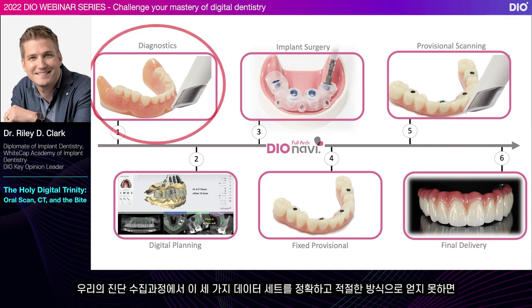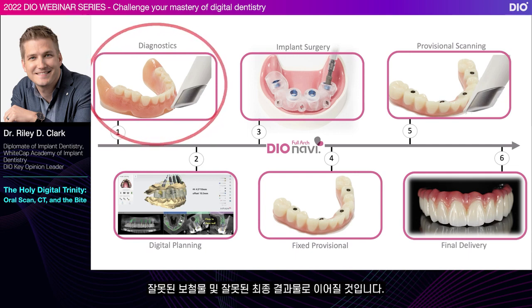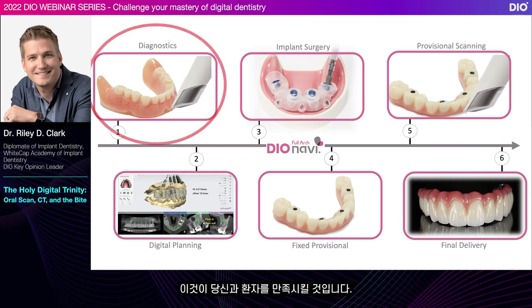If our diagnostic gathering, if these 3 data sets are not obtained in an accurate, proper way, then step 2 will not be done properly, which will lead to bad surgery, bad prosthetics, and a bad final product. Really, what we're talking about is the foundation of thoughtful, predictable workflows that leave you and the patient happy and satisfied.